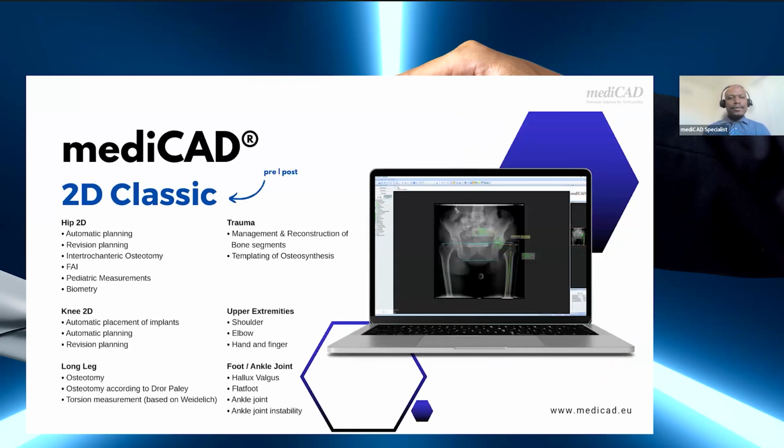The 2D Hip Classic software includes hip, knee, long leg, trauma, upper extremities, shoulder, elbow, and so forth, foot, ankle. You can do osteotomy. You can do so many amazing things with the 2D Classic. It is on-premise. Also, we have it available in the cloud, which is the web-based version of it.